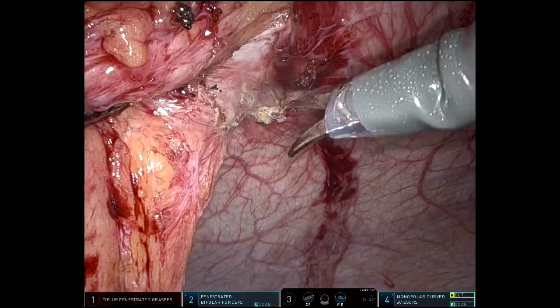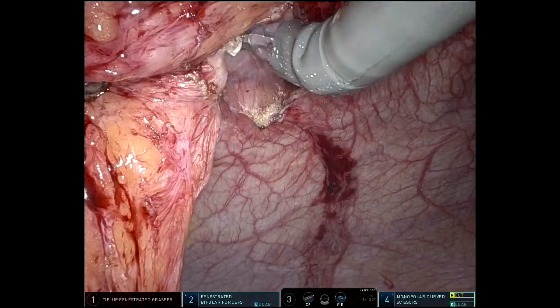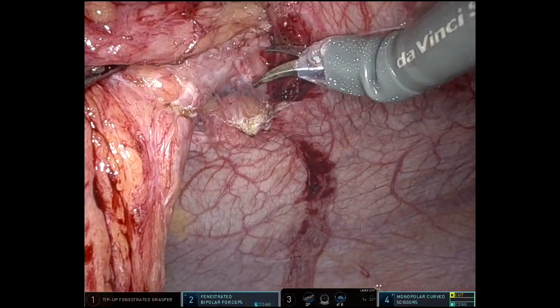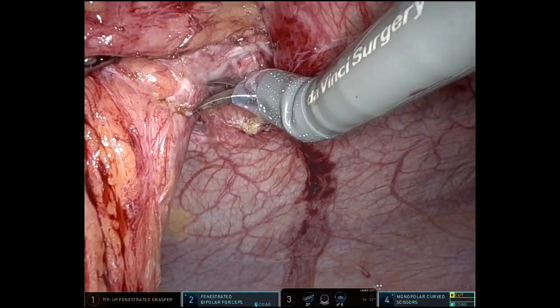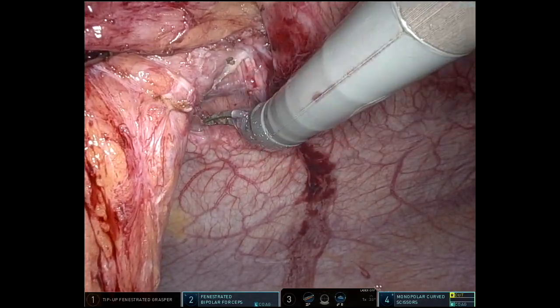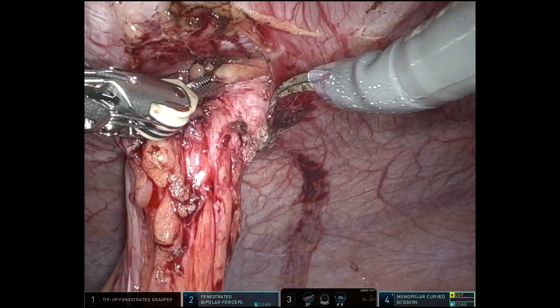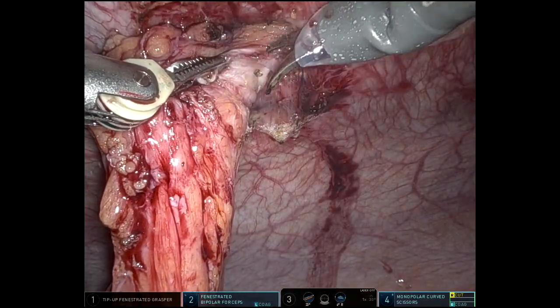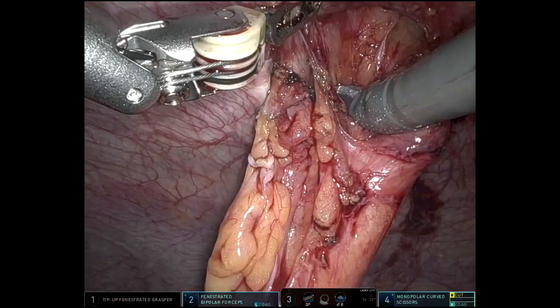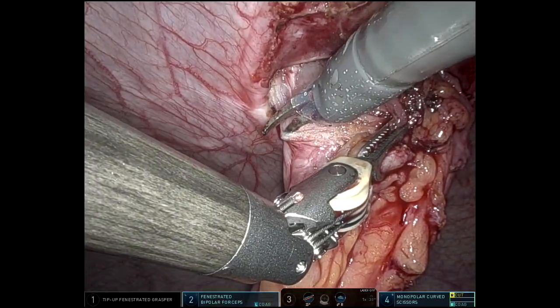My port placement for this case is similar to doing a left colectomy or a sigmoid colectomy, but I stood the ports up even more straight. Right lower quadrant, I have the 12-millimeter stapler port. In the right periumbilical area, probably five to six centimeters to the patient's right of the umbilicus, is the camera port. Then I have two 8-millimeter ports going up from there, and an assistant port in the right flank area. It was sufficient to do the operation.